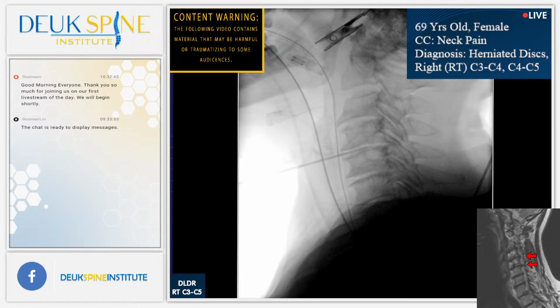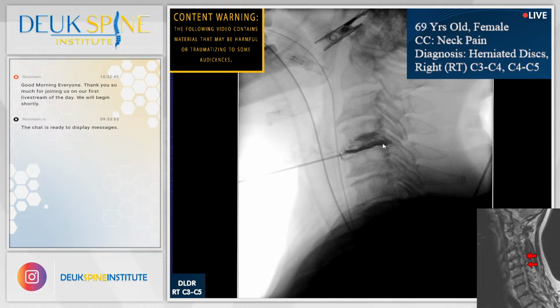Shot. I'm injecting some dye. You can see the tear in the back of the disc. That's what we're here to fix. She's got a combination of herniation and bone spur. We're going to try to get out as much as we can endoscopically. Injection.